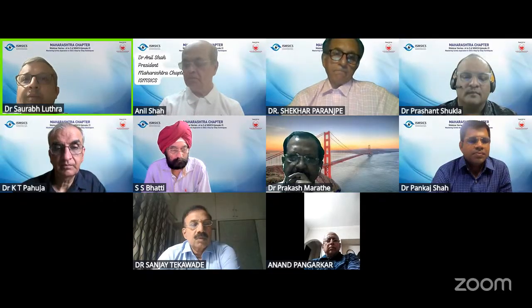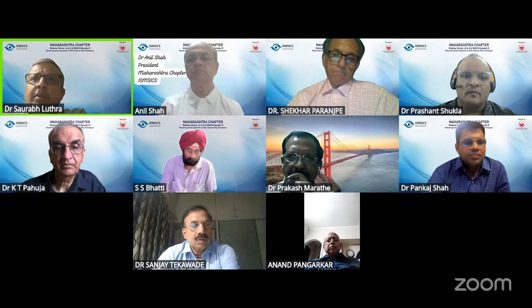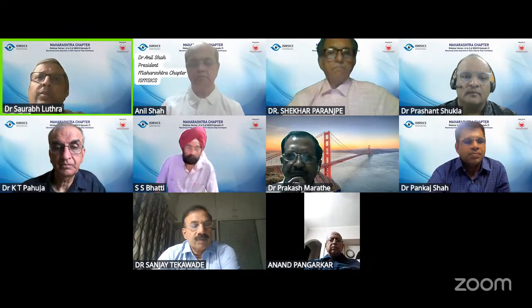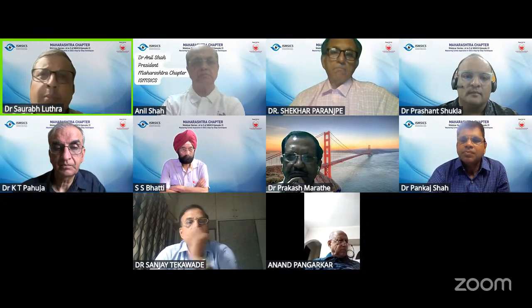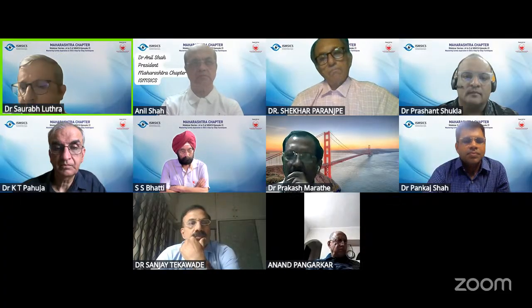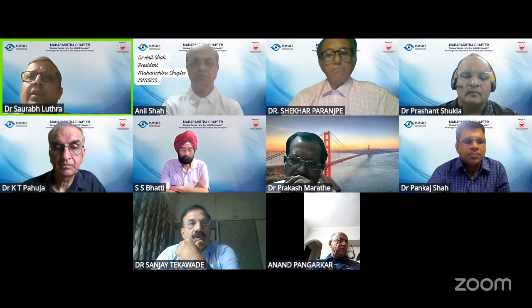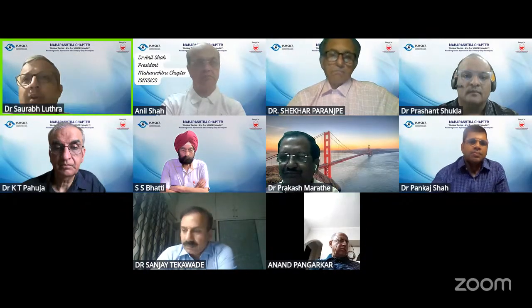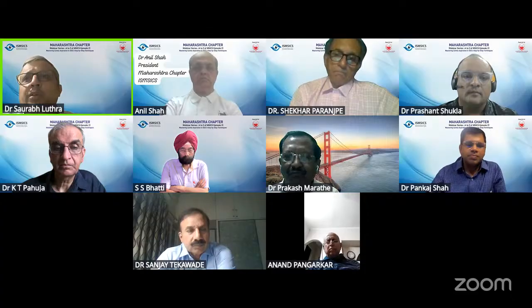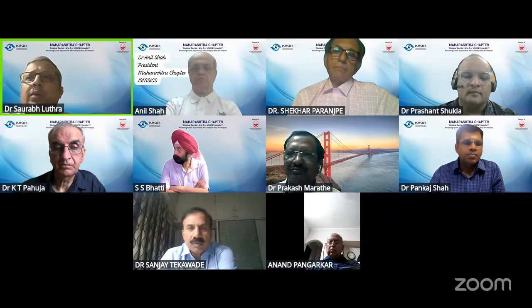But there are a few takeaway points from mine. Of course, whenever you want to convert, as Dr. Prashant guided, on that mature cataract day when he felt that it's going beyond his hand, it is always better to convert. And in the open chamber cases where the tunnel is not that great, or those floppy iris cases, I would still go ahead with my Simcoe only to be on the safer end, because those automated versions would at times give away, and that sudden gush of fluid will obviously make the AC go haywire. So I think the good old Simcoes work better in my hands.